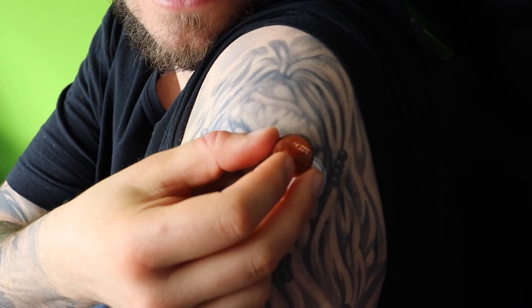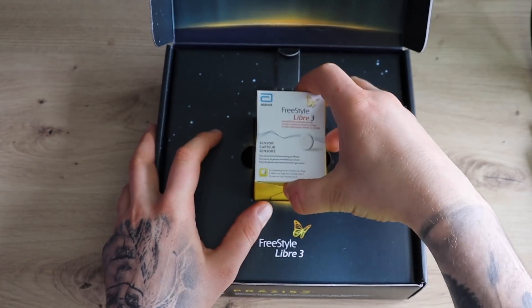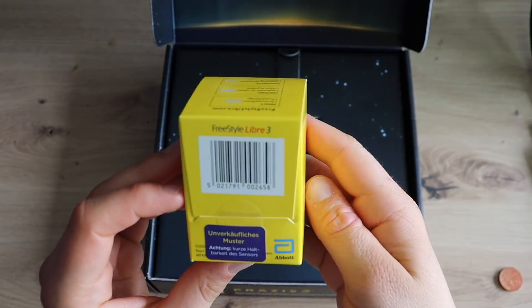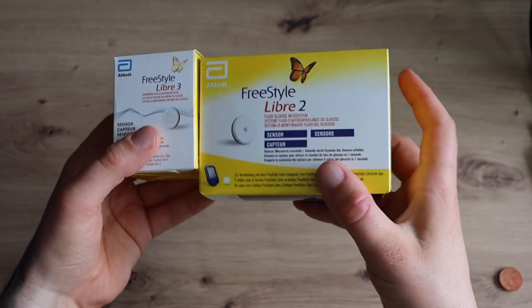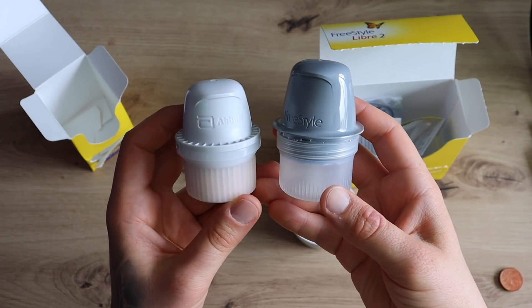Really impressive. And I find it really cool how they included the coins in the special package to represent the size of the Freestyle Libre 2 compared to the Freestyle Libre 3. I heard in your video that they actually reduced the size of the Freestyle Libre 3 packaging by 70%, and that they are using 40% less plastic and 40% less paper in the package. I think that's really cool and a good sign that Abbott also cares about the environment.